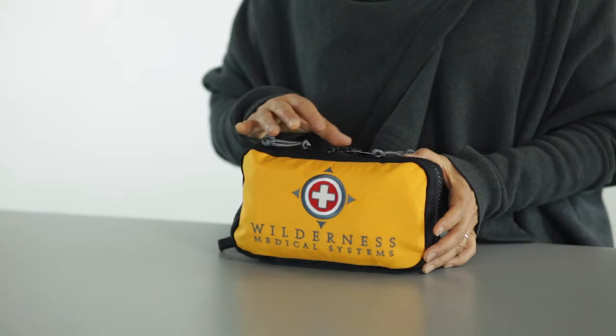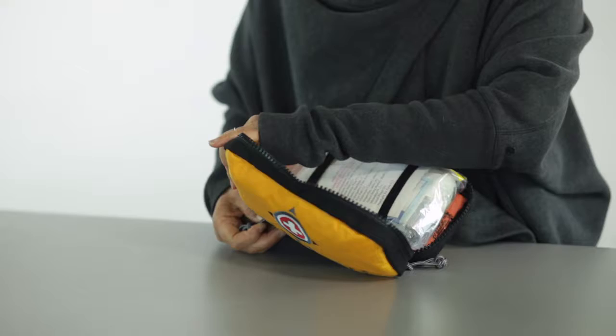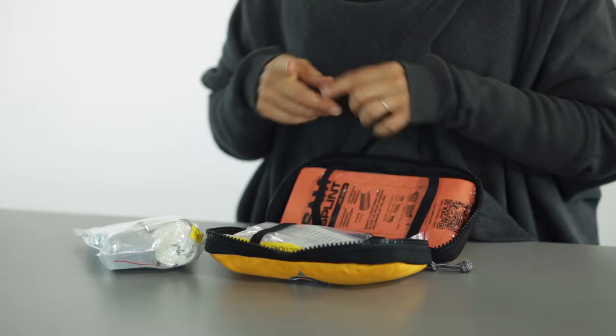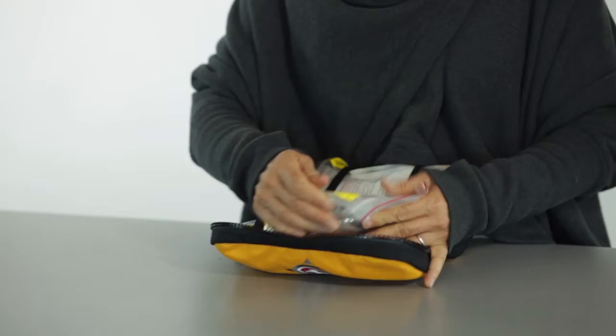The kit is organized into two modules in one compartment. This module has everything from an emergency first aid blanket to things for blisters, burns, eyes, and your non-prescription medications. We've got a SAM splint in here, which is handy to splint everything from a broken finger all the way to a leg and ankle.